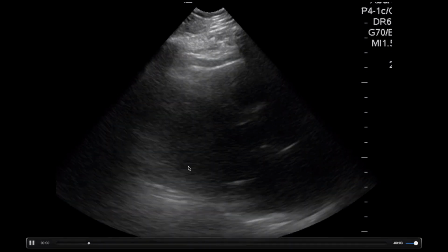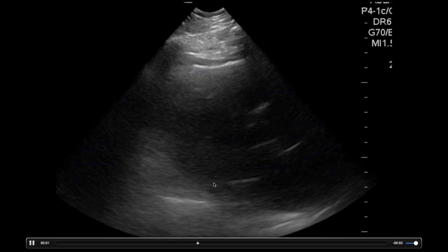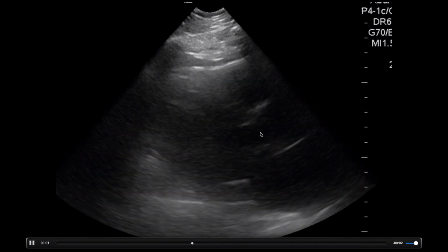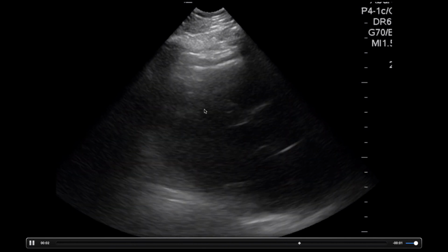This patient has a really rapid rhythm. And you look at the left ventricle here in the parasternal long view, aortic valve and mitral valve here. These are challenging views, but you can still see that there's opening here of the valve and that there is organized movement of the heart.